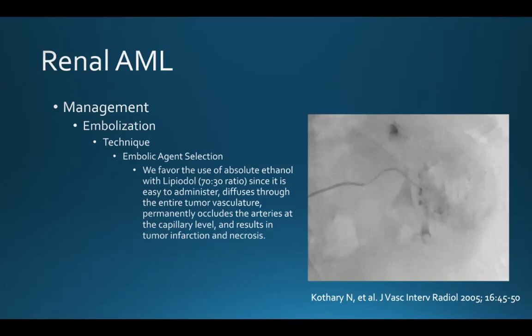And really, most importantly, it's pretty cool to do, because as you watch this embolization, you can see the lipiodol droplets carrying the ethanol out into the distal portion of the tumor. And that's always very gratifying during a procedure.